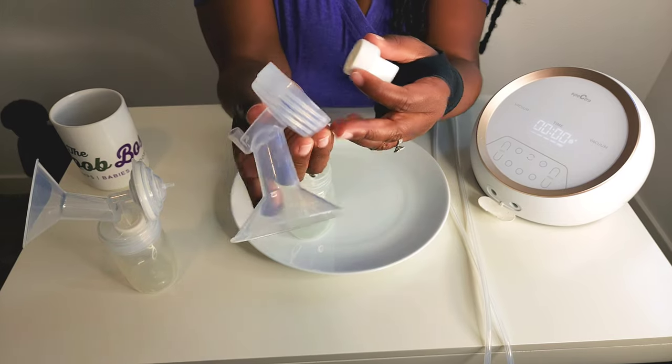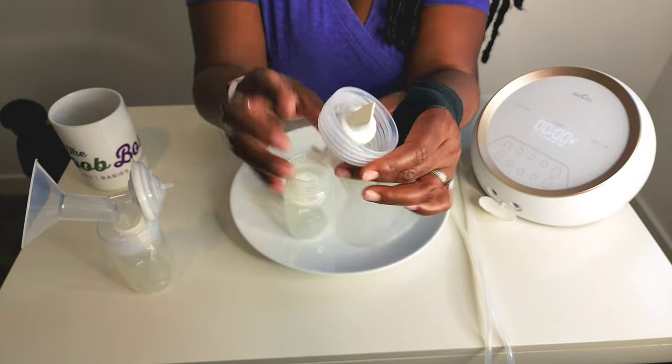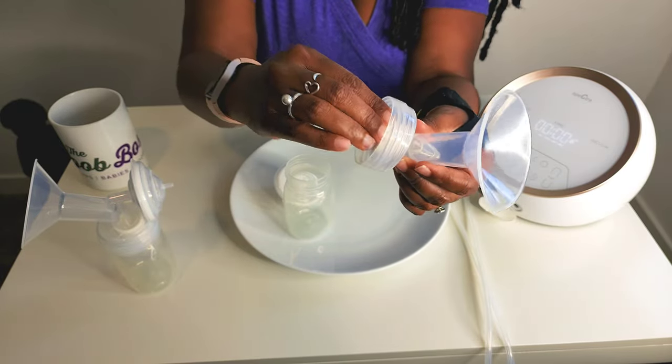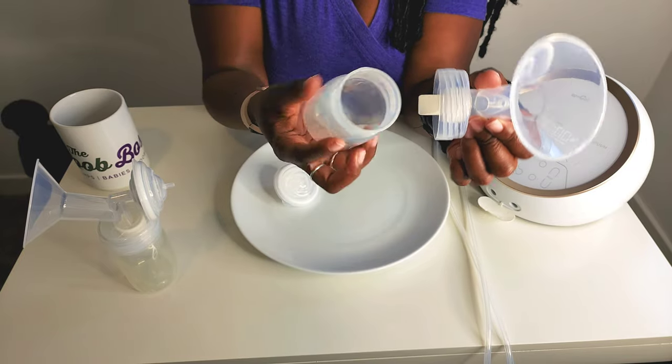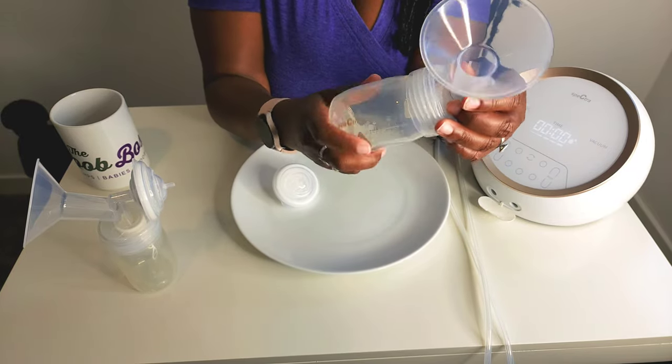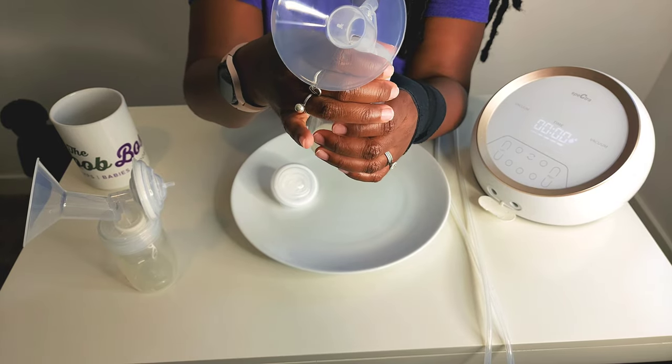Your duckbill is going to go right inside your flange. So right in here. You also want to make sure that it is in there really nice and snug. And then you're going to screw this on your bottle. The Spectra Gold bottles have Spectra written in gold. The S1 and S2 have them in pink.